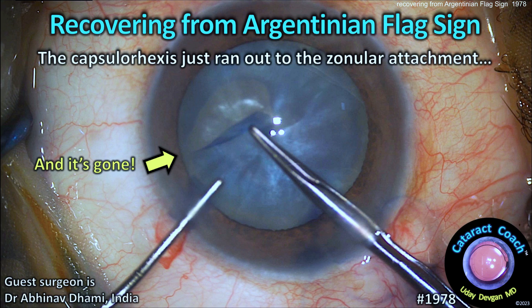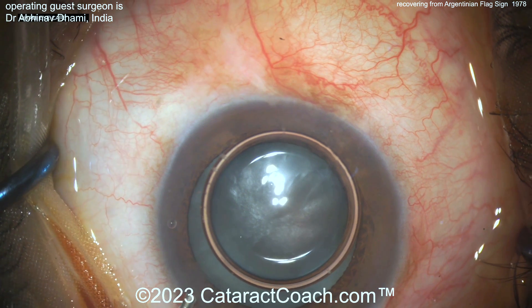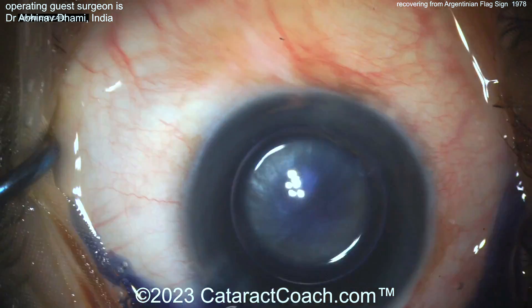Cataractcoach.com — recovering from the Argentinian flag sign. The capsulorrhexis just ran out all the way to the zonular attachment. Now what are you going to do? Let's watch the case here.